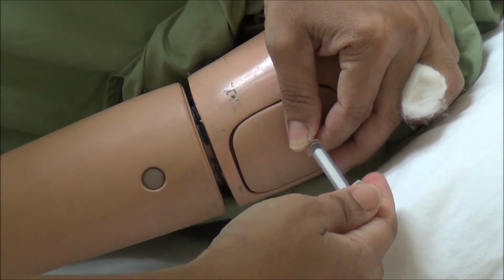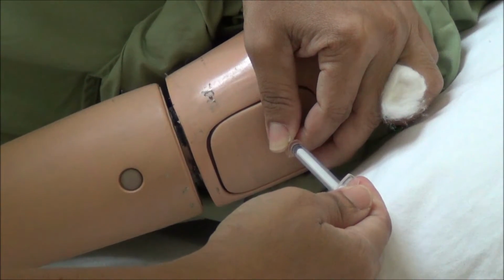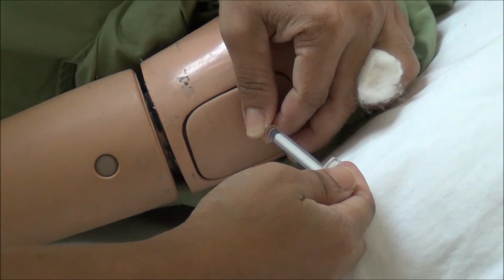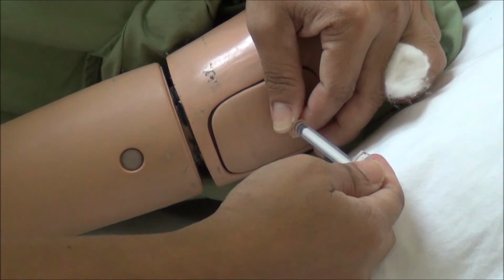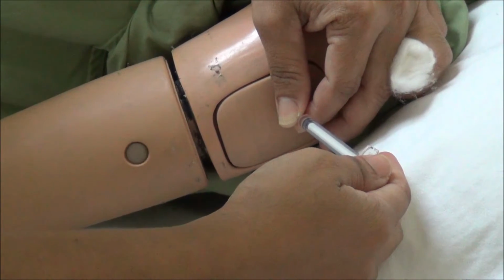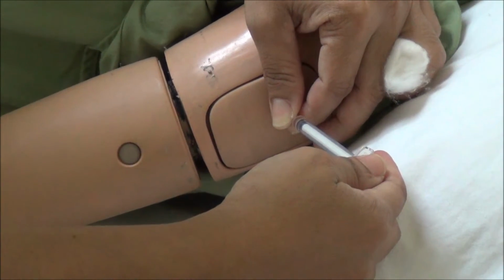Aspirate by pulling the plunger with dominant hand and observe barrel of syringe for blood return. If there is no blood return, then you are at the correct subcutaneous tissue. Inject the medication steadily and slowly while holding the syringe steady.